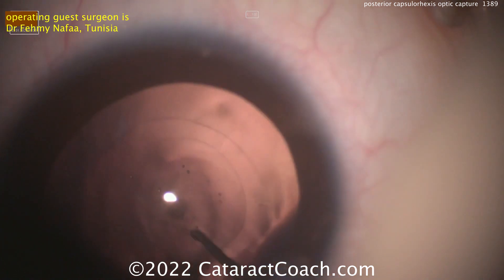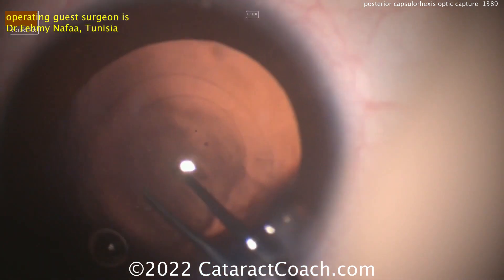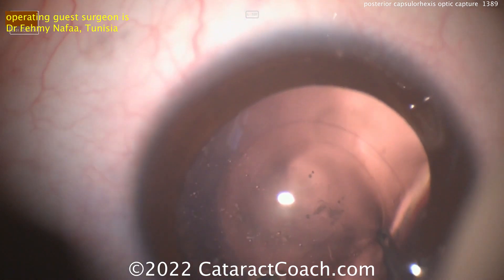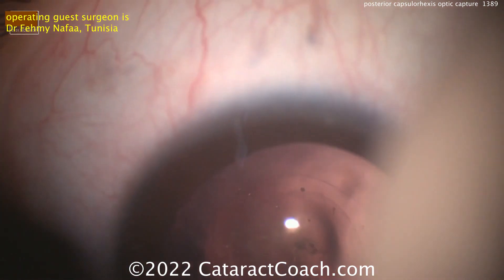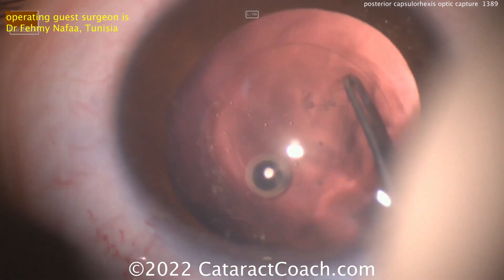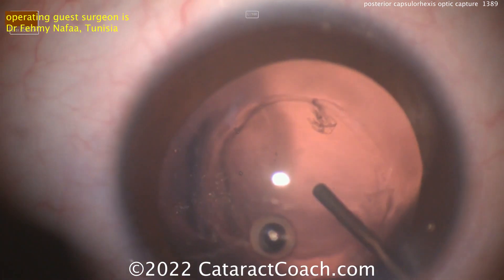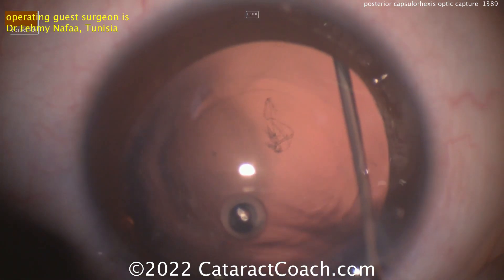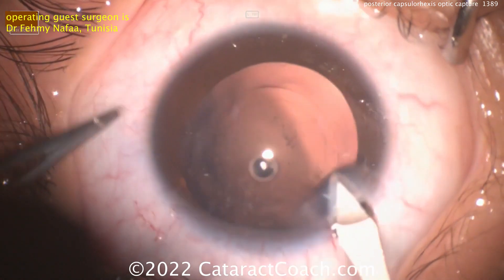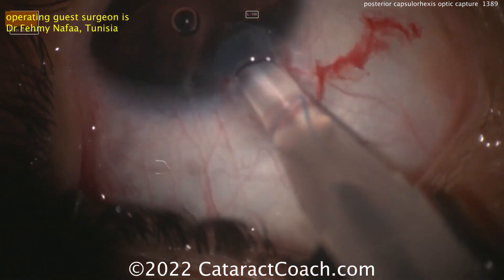The question is, do you need to adjust IOL calculations for lens position? Think about it — if you change the ELP, the effective lens position, you may want to make some adjustments. We know from straight sulcus placement, if the optic is in the sulcus, that's more anterior, so we need to lower the IOL power to get the same post-operative refractive result. Similarly, if you're placing the optic behind the posterior capsulorexis, it's going to be deeper in the eye — farther from the cornea, closer to the retina — so we need a little bit higher IOL power.